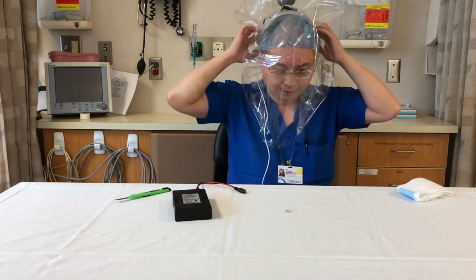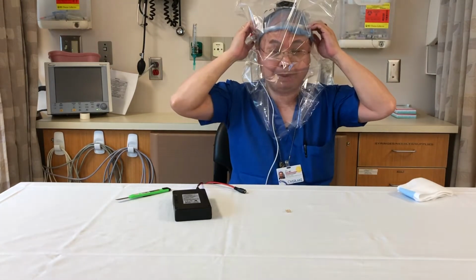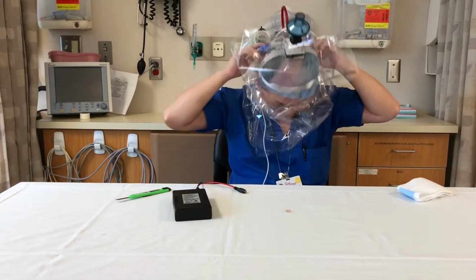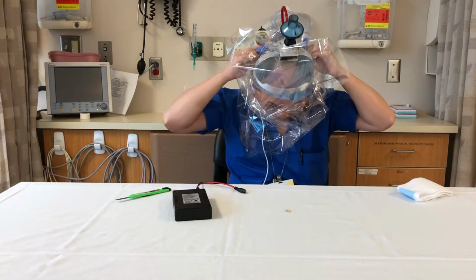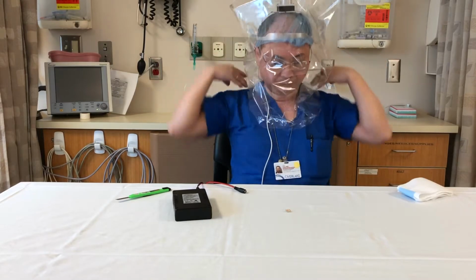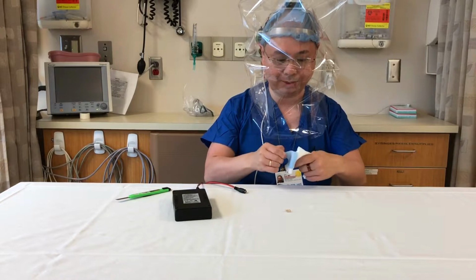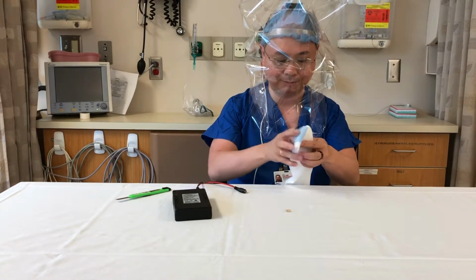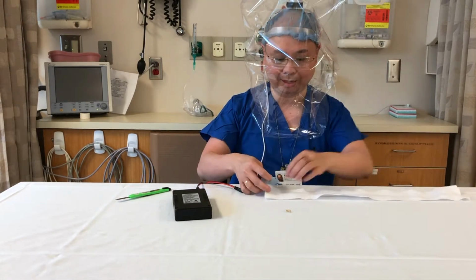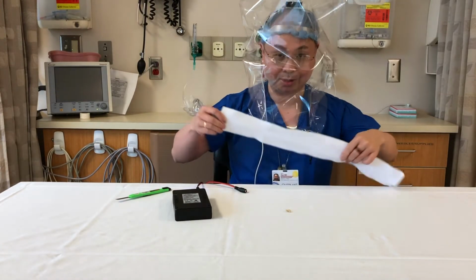Put it over your head. It seats down much like a baseball cap for the band. I've got these centered left, right in terms of rotation. I bring the bag down, and I put my strap on around my neck. It only needs to be about the same as a necktie in terms of tightness. You want it tight enough so it stops airflow, but you don't want to, of course, cut off your circulation.